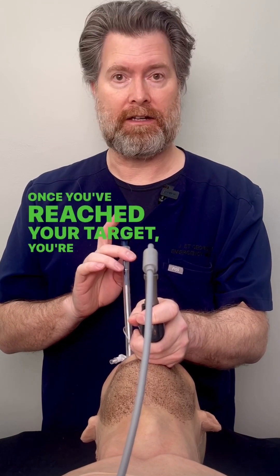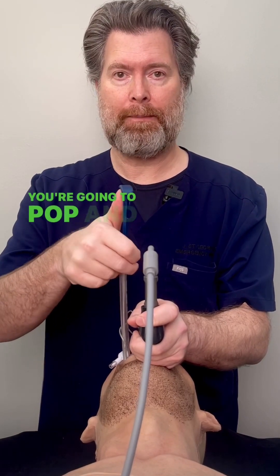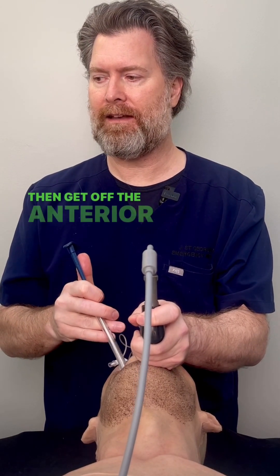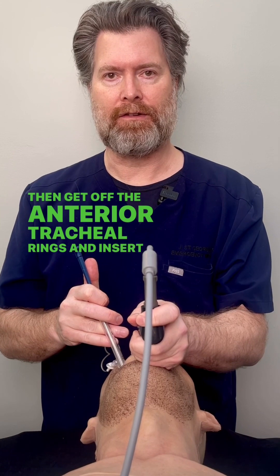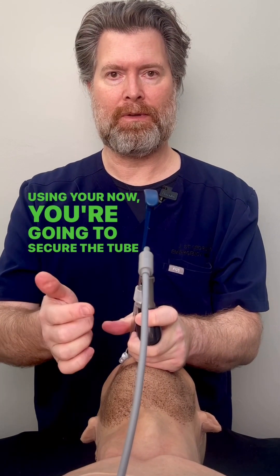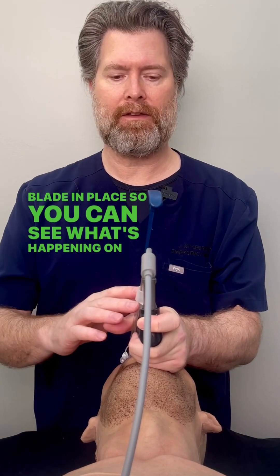Once you've reached your target, you're going to stop, pop, and drop so that you can get off the anterior tracheal rings and insert the tube. Using your thumb now, you're going to secure the tube, leaving the blade in place so you can see what's happening on the screen.